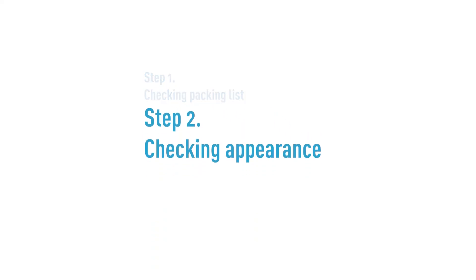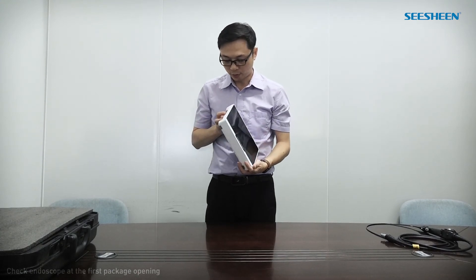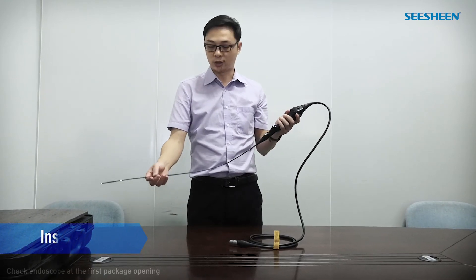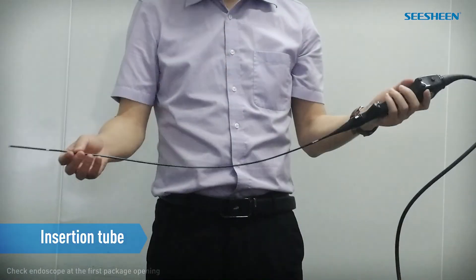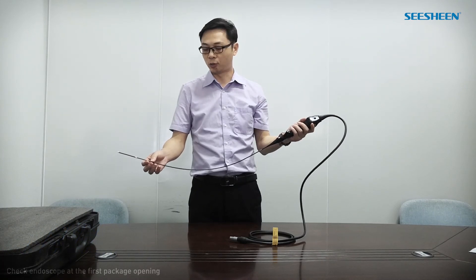Step 2: Checking appearance. Check the appearance to see whether it is complete and clean. Please be careful with the insertion tube. Hold it lightly and gently. Do not crush it with a hard object.